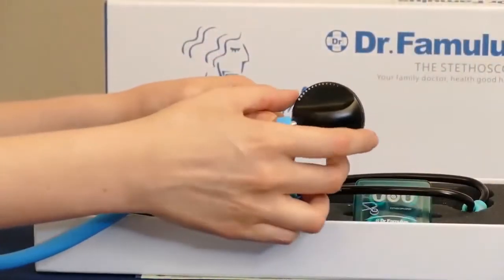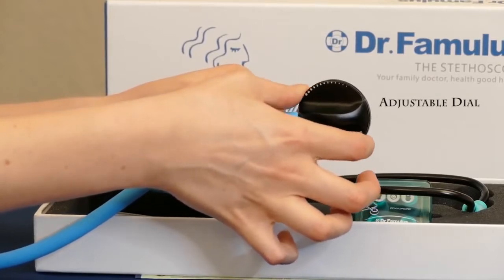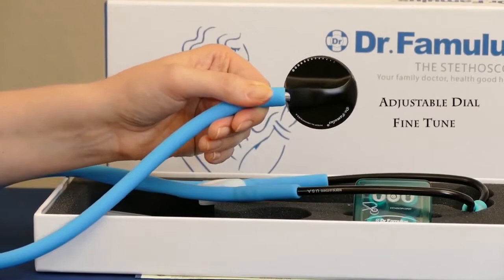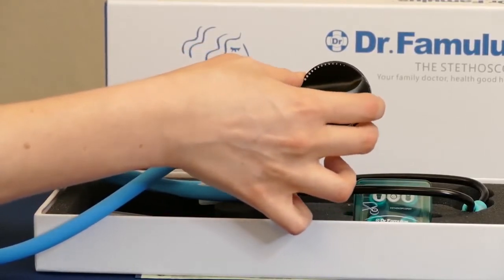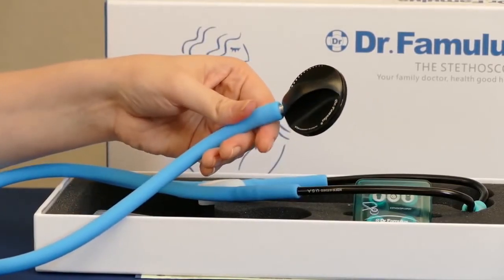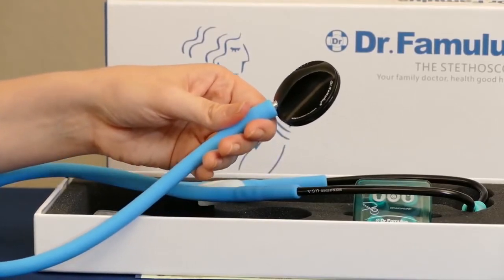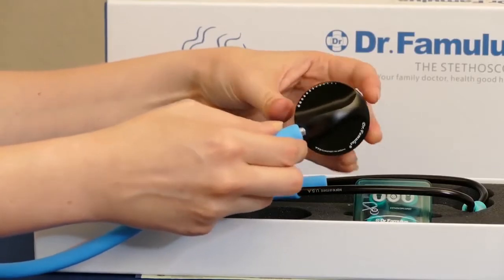The chest piece also has this little adjustable dial so that you can fine-tune for the different sounds you're listening for, and I think that's really handy because it makes this a much more versatile stethoscope — you can listen for louder sounds like breath or heartbeat, but it can also be used for other frequencies.